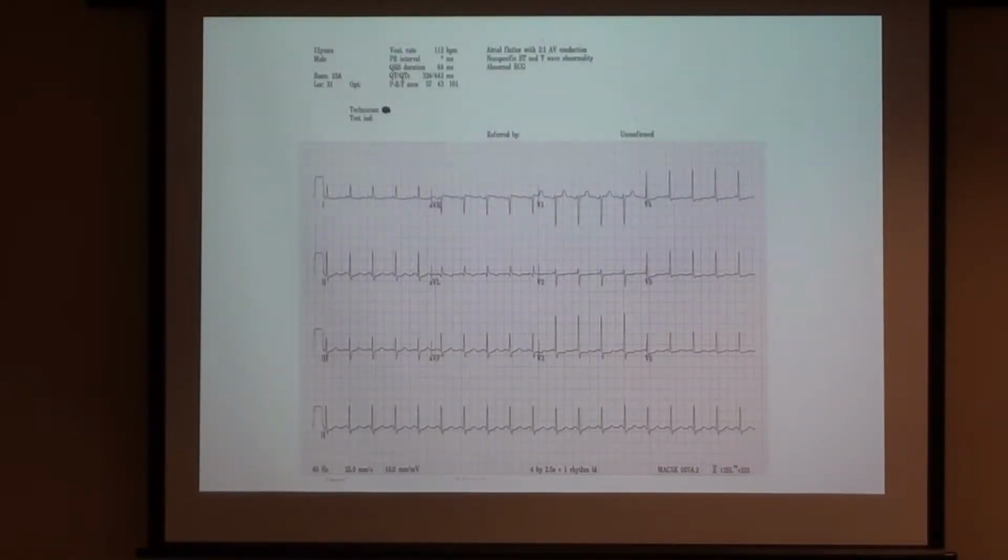And in fact, some of us cardiologists will sometimes make it a really fast paper rate so that you can really accurately measure the timing of all the electrical events. And sometimes you compress it, like on a Holter monitor, where you can see a whole day's worth of QRS complexes on one page. So a standard EKG is 10 millimeters per millivolt and 25 millimeters per second. Those are the standard settings. But it's valuable to know where that is and what that means.